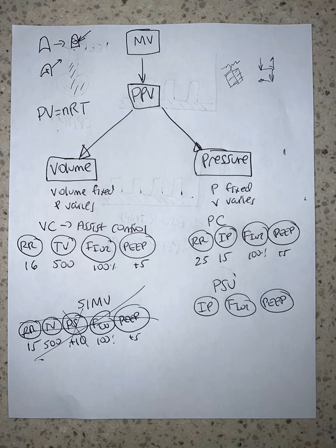So one time when I first started my practice, I had a patient on pressure support of 20, okay, and they got a tidal volume of 500. It was the exact same as assist control. But the respiratory therapist overnight didn't understand that, called my partner overnight, who asked why he was on that, and then switched to the ventilator, and then my boss says, why are you weaning that patient? I go, I wasn't weaning the patient. I didn't argue with him. I was giving them the pressure support of 20 because it's more comfortable for the patient, and I'm doing the exact same thing as assist control. Okay? It's just a different way of doing it.